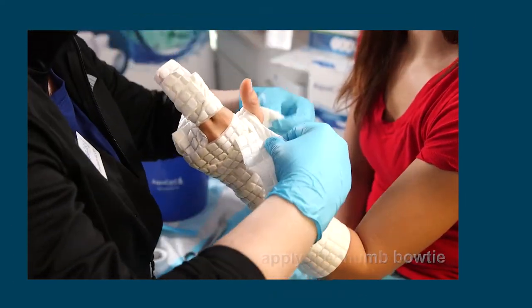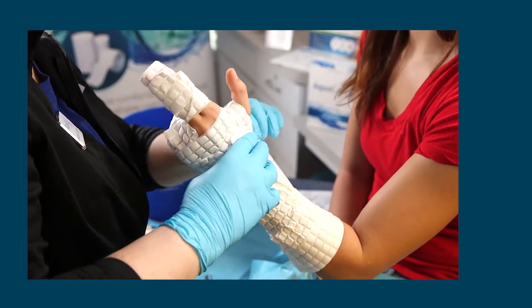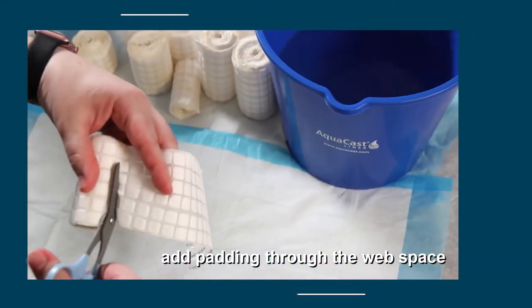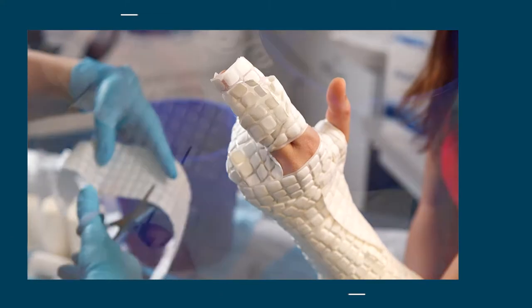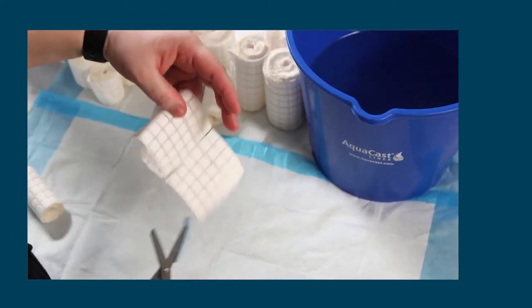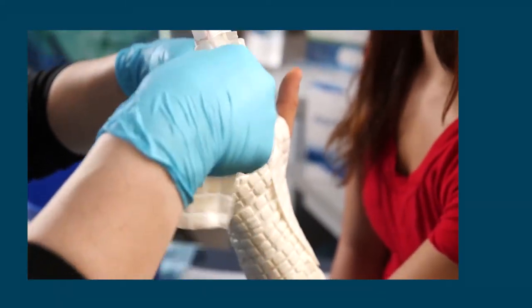Apply the thumb bow tie. To add padding through the web space, add a second bow tie using a three or four inch roll. Make cuts six or seven pads wide. Lay the material between the fingers.